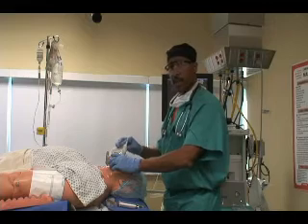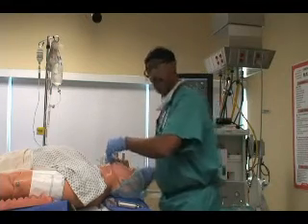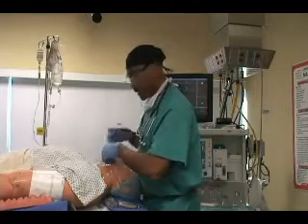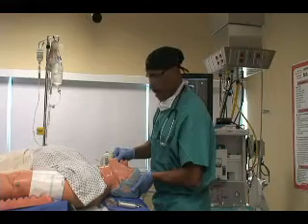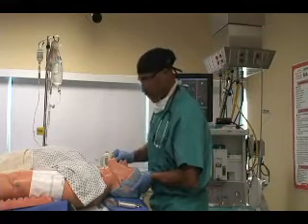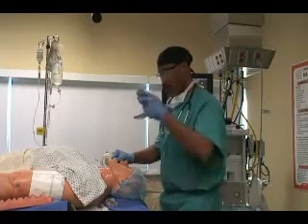Once your patient is properly oxygenated, move your mask, tilt your patient's head back a little bit, take your right hand, insert it into the mouth in a scissors fashion, open the mouth, take your laryngoscope, open your laryngoscope.